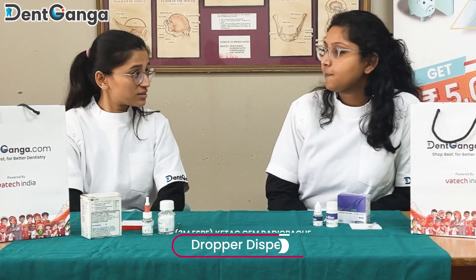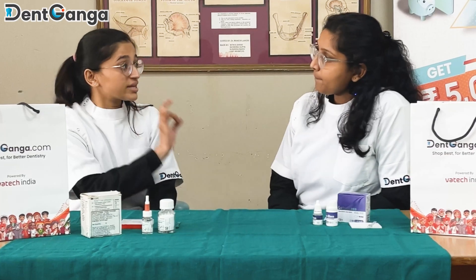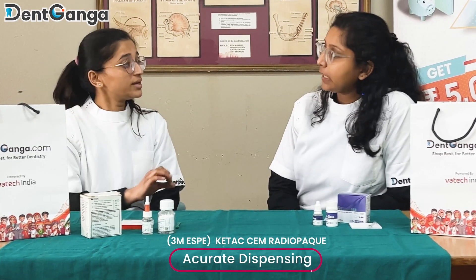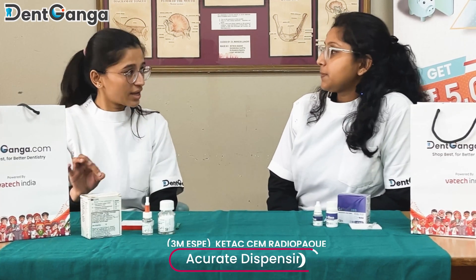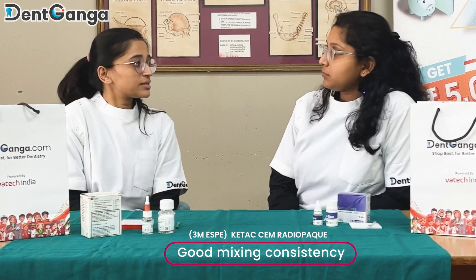One is the powder and one is the liquid. I love my dispensing bottle because it comes with a dropper dispenser where the dispensing of the liquid is just accurate — my two drops are very accurate and the mixing is very consistent, so it gives me a better result. It's cost-effective and I can use this for at least three to four months in my clinical practice.